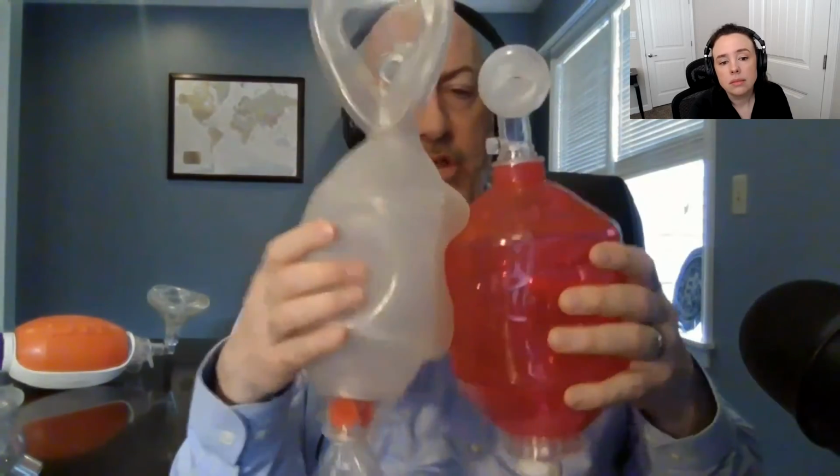And this is really the first one that came out that addressed pressure. And how this works is, if you see, I can squeeze that BVM, but I really can't squeeze it as fast as I can this one. I'll try to do it at the same time so you guys can see. This is your normal BVM. I'll try to squeeze them really fast at the same time. You can see that this one went in much quicker. So this is made more round and it's a thicker plastic.